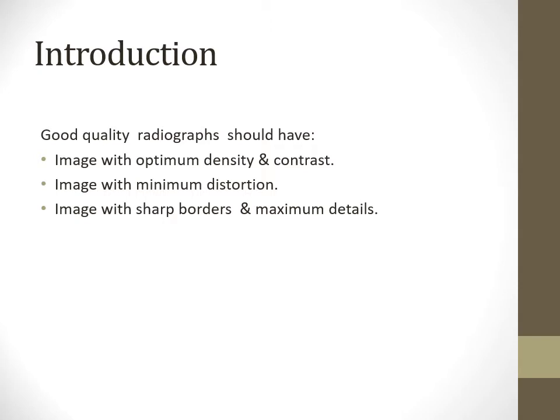With all these, we can give a very good diagnosis of any disease or any disorder. For a good radiograph, the contrast has to be good, the density has to be good, minimum distortion should be there, and the image should be sharp with maximum details. These are the must for a good radiograph.